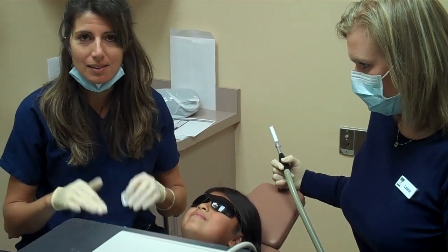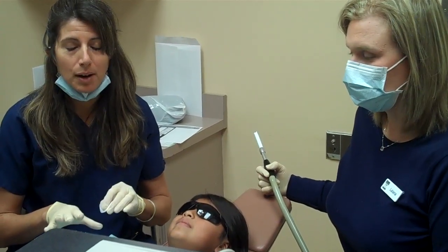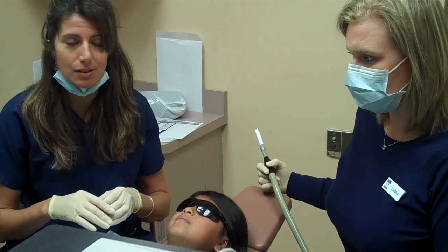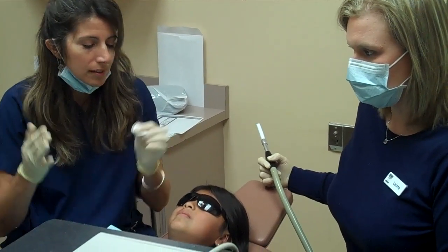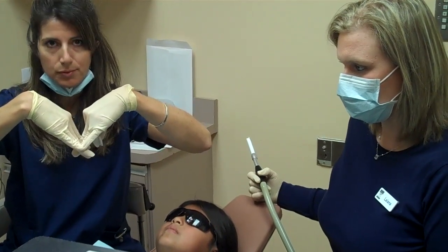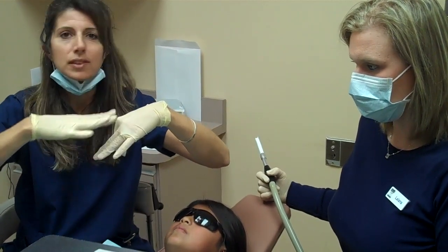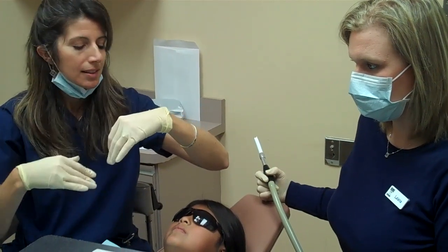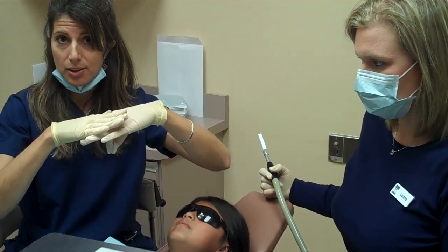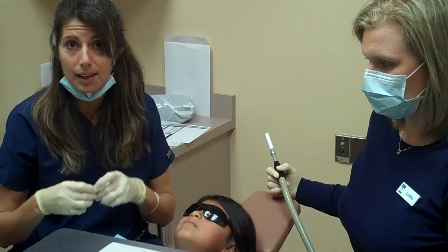A sealant will protect the tops of their teeth where they have really deep grooves, which is the primary area where children will get cavities in the younger years as the teeth erupt. A tooth normally has a very deep V groove, and if you were to eat an Oreo, the Oreo would get stuck in that groove and leave black in there. The sealant's going to take that V, flatten it out, and if you were to eat the Oreo later, it would slide right off the top of the tooth and help her not get cavities there.